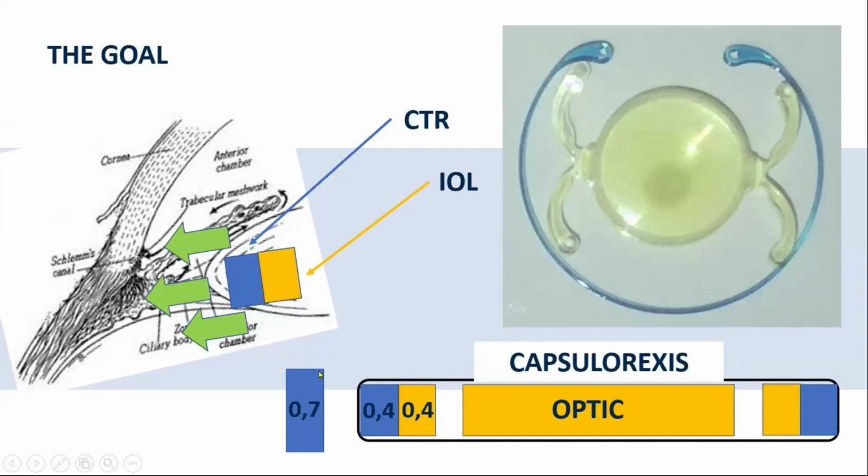And this is the example of the Morcher ring, which is too big and would keep the bag so open that the intraocular lens will keep on moving. And this is to show you that by placing the CTR in the right place, you do the stretching against the zonular area, against the equator of the eye.